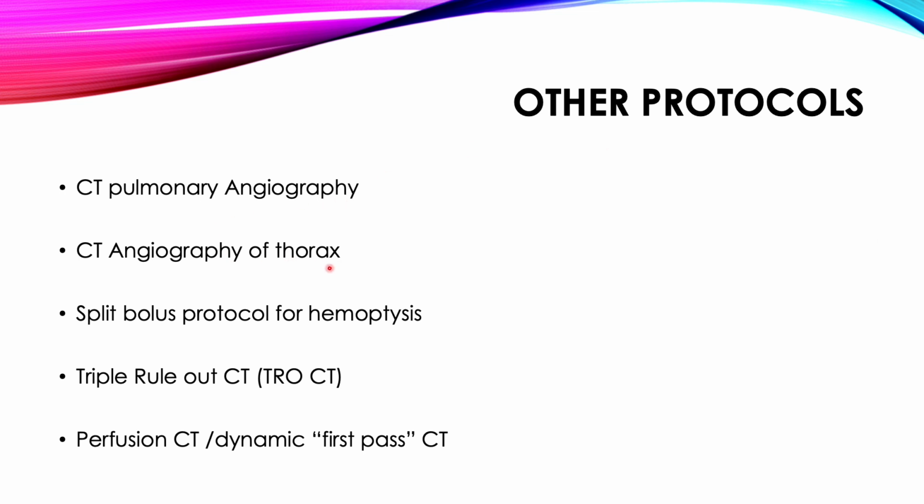The other is CT angiography for systemic arteries. We use it primarily to focus on the systemic circulation and not the pulmonary. So we use it for the aorta and its branches. For example, evaluating hemoptysis or doing pre-procedural imaging before a bronchial artery embolization is done, or you are suspecting aortic dissection, aortic aneurysm, or there are anomalous arteries, congenital malformations, like in a case of a lung sequestration, we want to know about the bronchial artery.